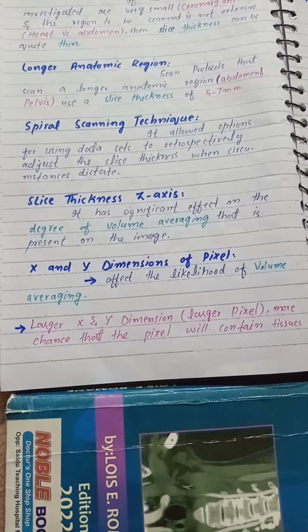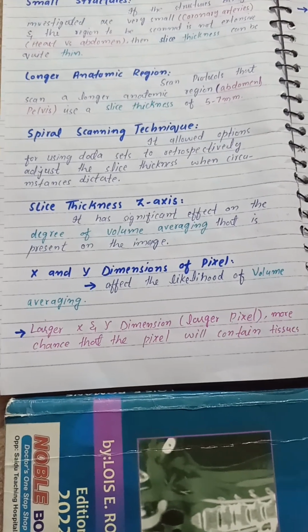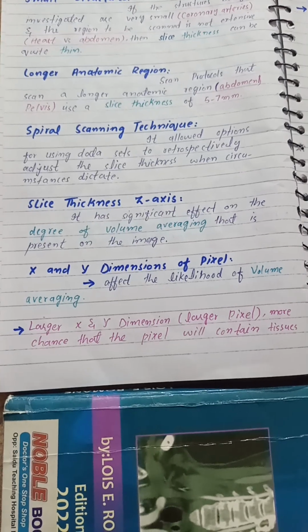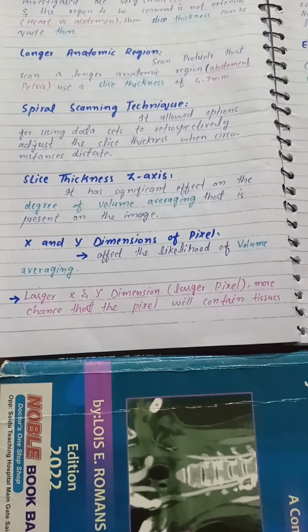Slice thickness, z-axis. It has significant effect on the degree of volume averaging that is present on the image. X and Y dimensions of pixels affect the likelihood of volume averaging.